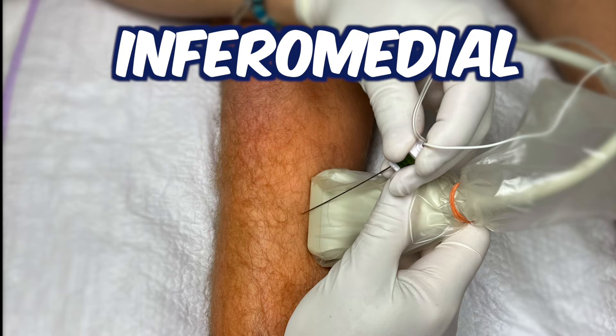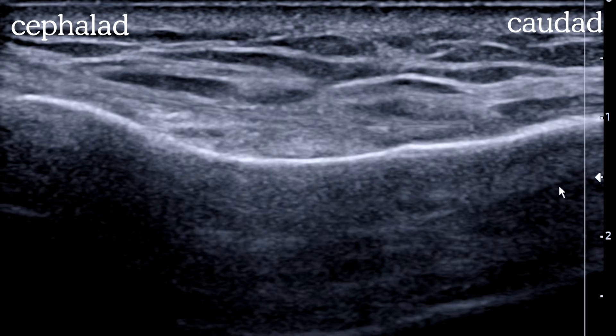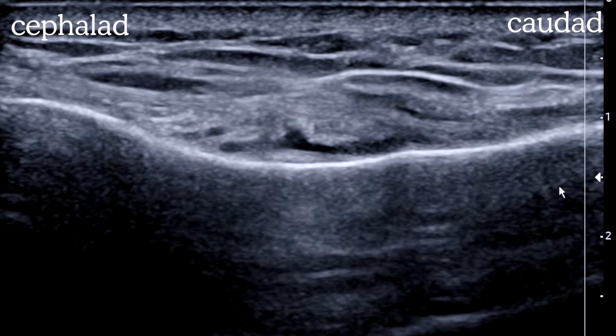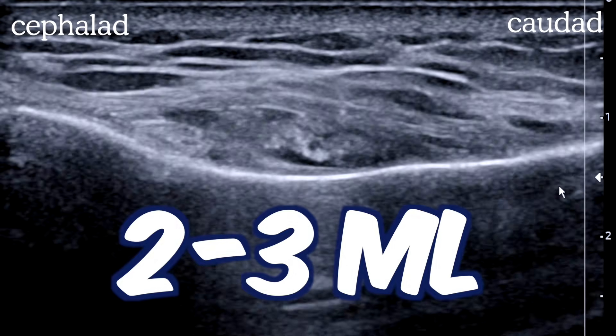For the inferior medial, we'll image the slight depression on the flare of the tibia. If you're going to see a genicular artery, this is often the one you'll see. Come in out of plane and land in the depression. This is the shallowest block and there's not much tissue there, so sometimes we'll only inject about two to three mils.